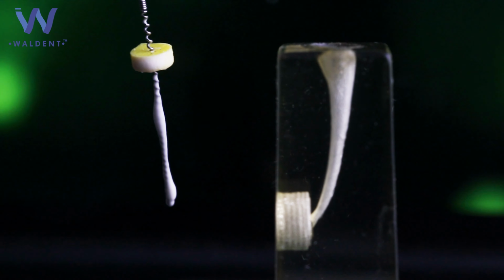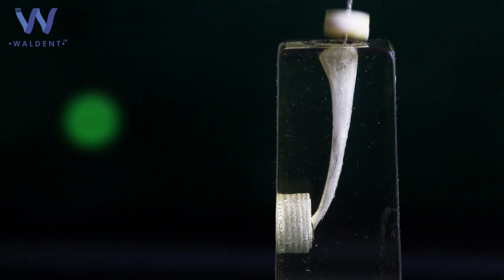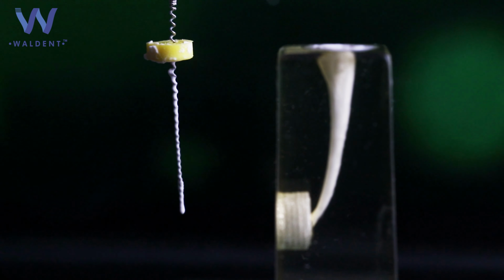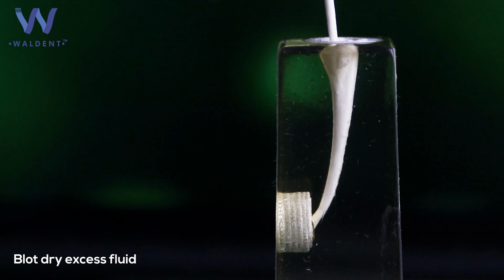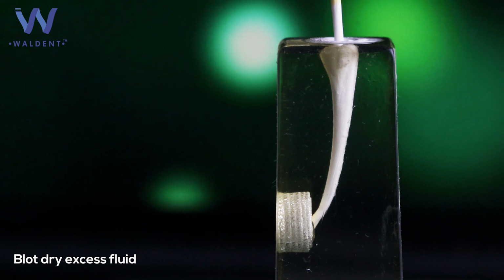Now coat the Lentulo spiral with calcium hydroxide paste and place it into the canal with a pumping motion. Repeat coating the Lentulo spiral 3 to 4 times or as required. Now with the help of a sterile paper point, blot dry the excess fluid and at the same time pack down the paste into the canal.